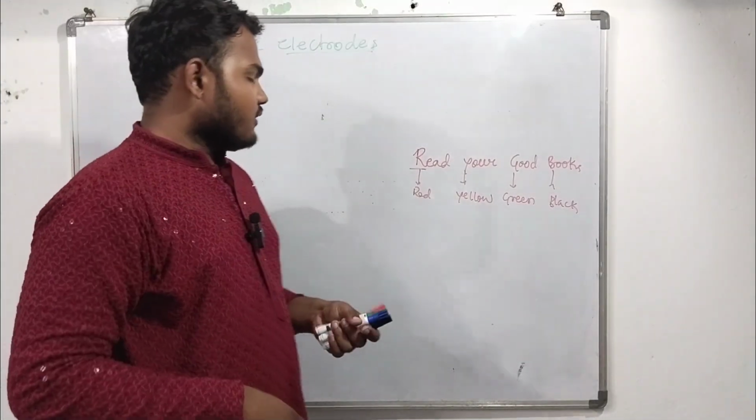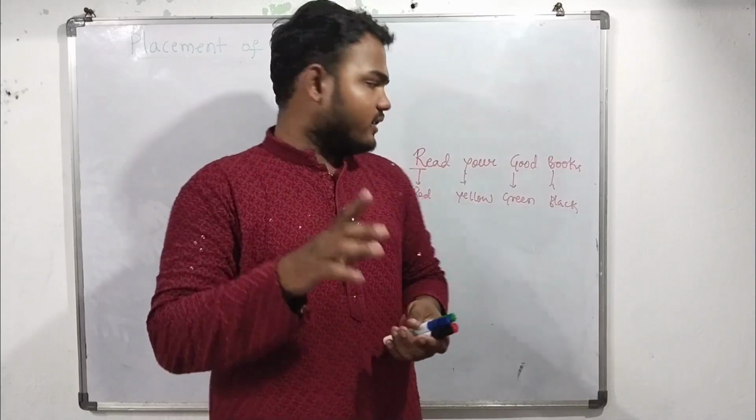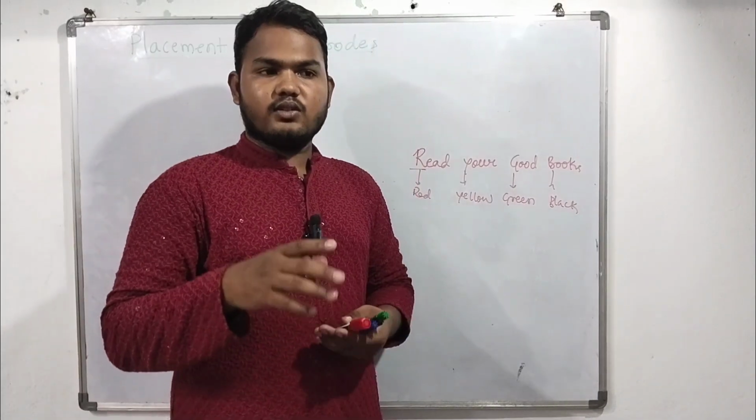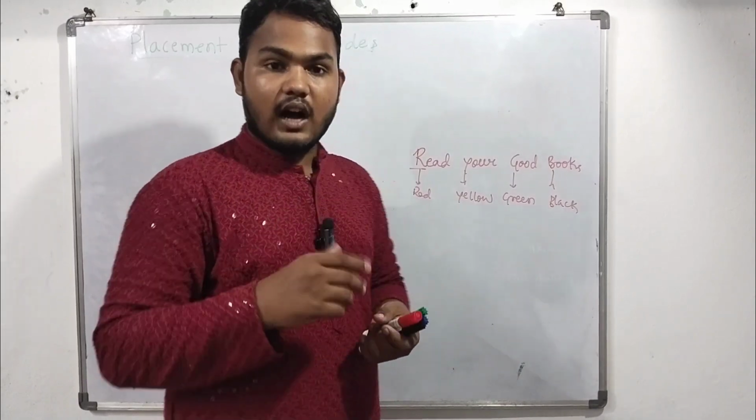Instead of learning about the chest leads, we will only see the limb leads. If you know the limb leads, then you also know the chest leads. How did the 12 leads come about?